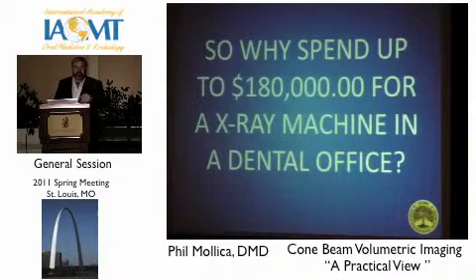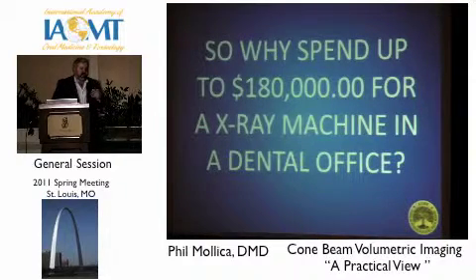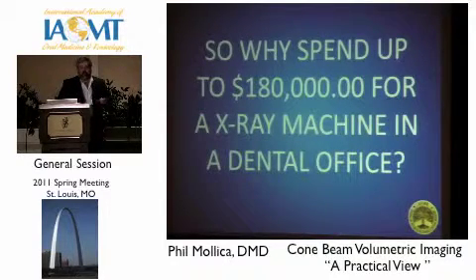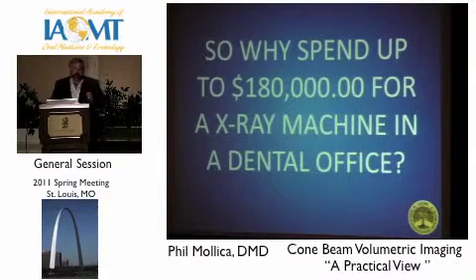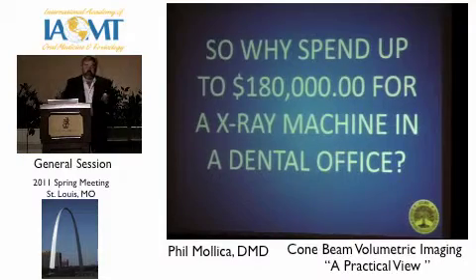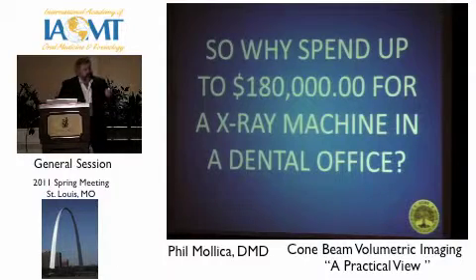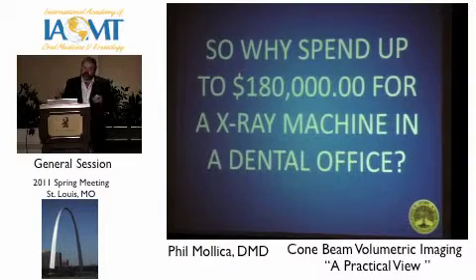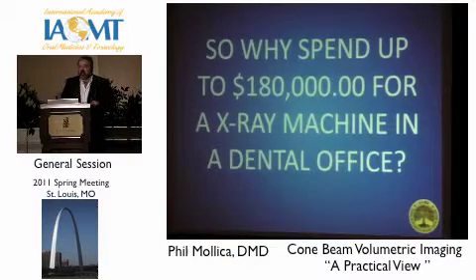Well, as we did with our computers, we traveled, we searched, and we keep finding ourselves, when we're looking for new technology, referring back to one system. In this particular case, it was always from Imaging Sciences, the iCAT. Now, we weren't so much interested in placing implants, but we want to look at the pathologic issues with head and neck. We're dealing in dentistry. What do we deal with? We deal with trauma. We deal with infection. Our world is filled with infection in dentistry. So this is a way to visualize that. And of course, I said, well, Kara, it's only about $180,000. What could that extrapolate out to a month?